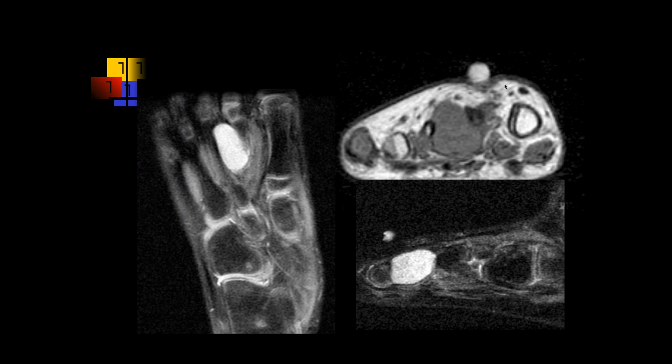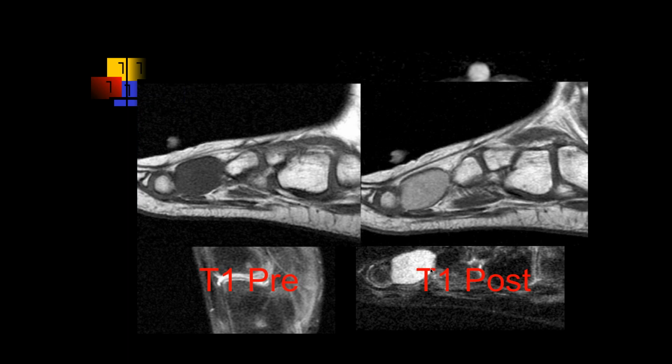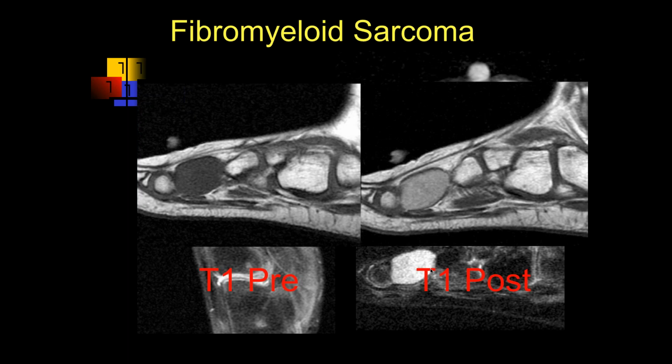Okay, so coronal, sagittal, and axial images of a patient's foot. Looks like we've got probably STIR and T1. In that second interspace, we see this kind of oval mass in the intermetatarsal space. T1 post, T1 pre, so it does enhance, and it is hypointense on T1. I was going to say a fibrous tumor with some concerning characteristics. But this one has nice sharp margins. It does, yeah. It's fairly uniform. Yeah, well circumscribed.